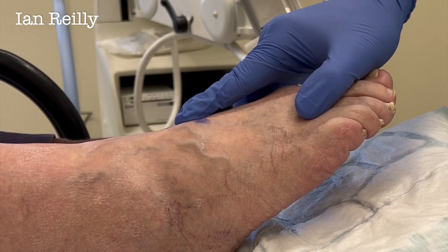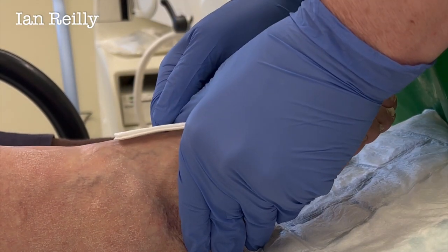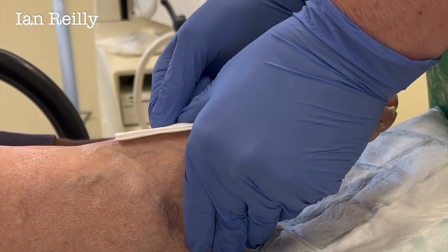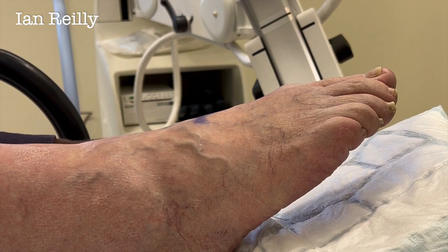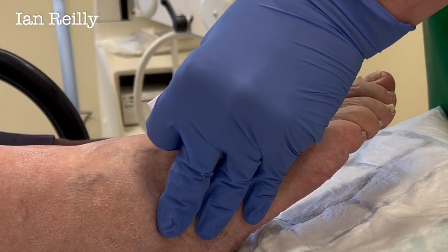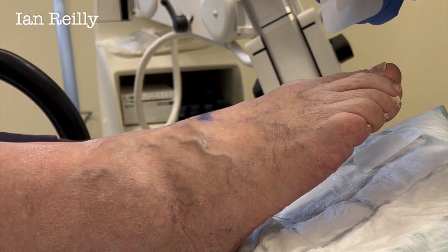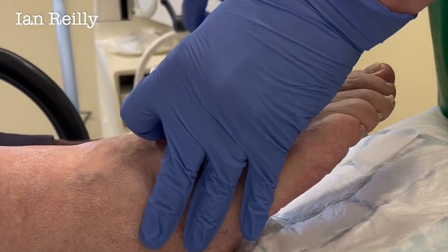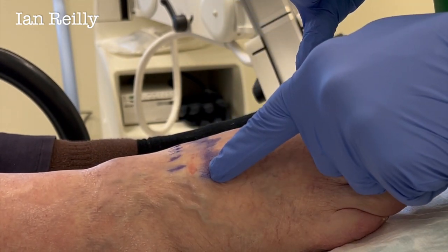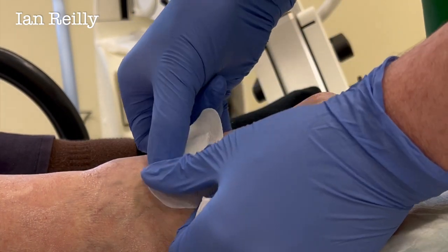How does that feel? How stingy was that on a scale of 0 to 10, Chris? It was a good sting — I could feel it getting there. So this is why we use x-ray, Chris — just before I turn the camera off. This was me marking up where I thought the joint was, but I was about a centimeter off. That's why I use the x-ray — so I'm in the right grid square.